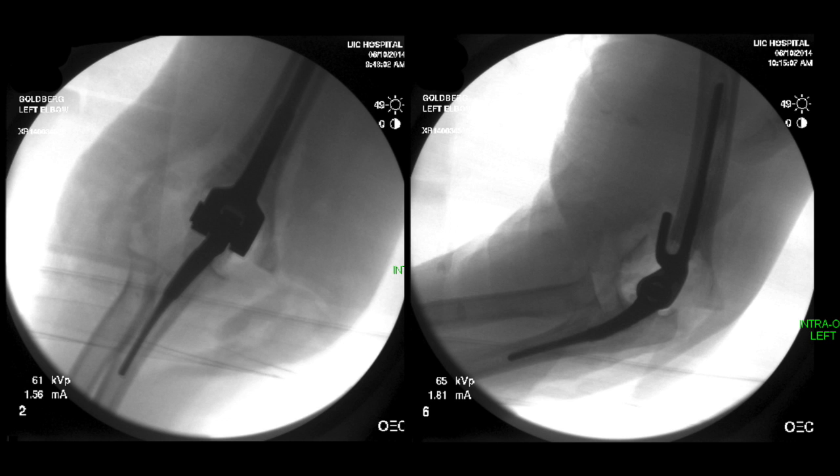Our technique for cementing is to use a small cement gun, cement restrictors, and runny cement to pressurize the canal.